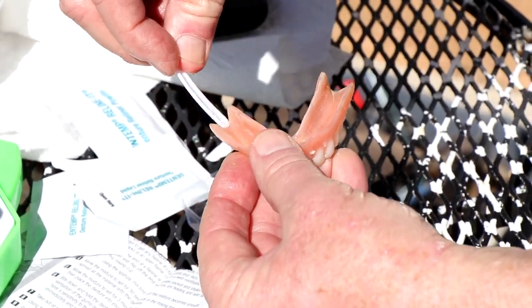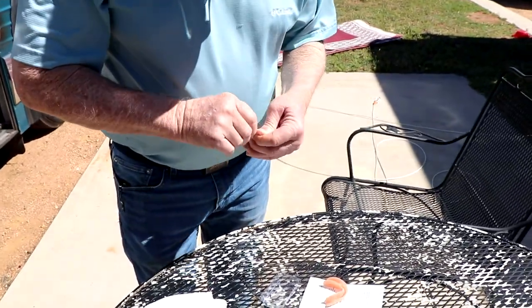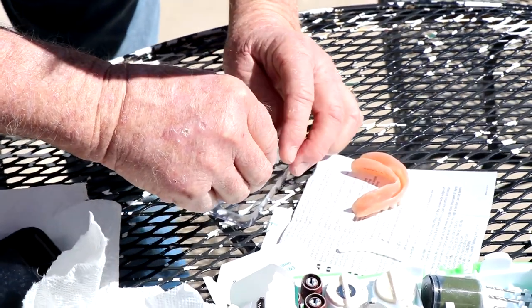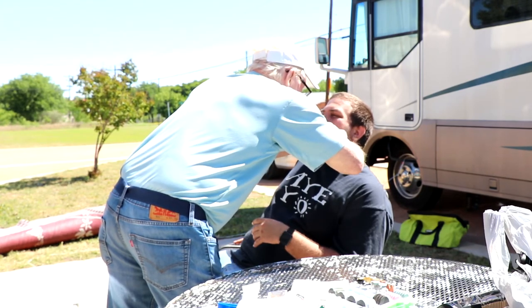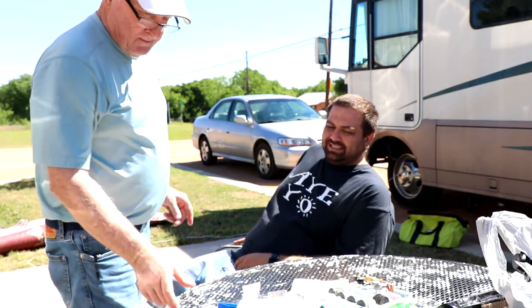If you don't put an etch on it, the material's not going to bond. To get a reline material, you have the liquid and then you have the powder - you mix the two together and you have a plastic. You're going to be there for about 10 minutes.